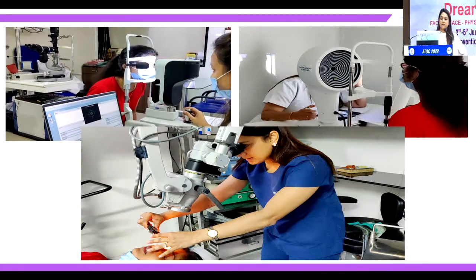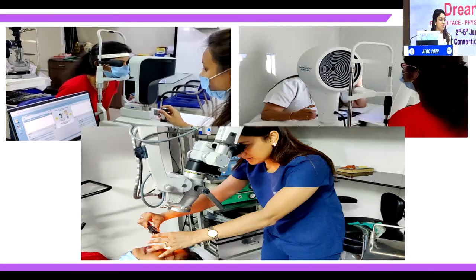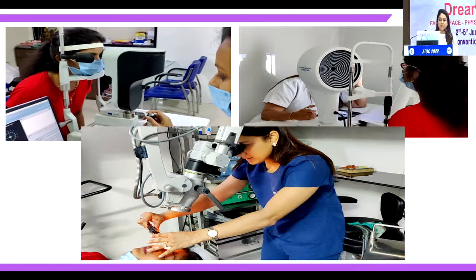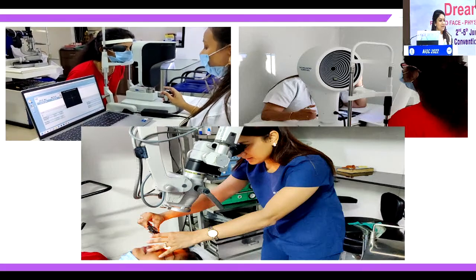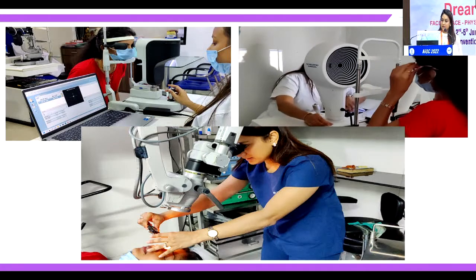So then comes the evaluation of the lens. An optical biometer is one thing which we need to do for white to white, of course, for the anterior chamber depth to reconfirm, and also for the keratometry and the axial length, because when these patients later come for cataract, it becomes easier for us to manage and calculate the IOL.